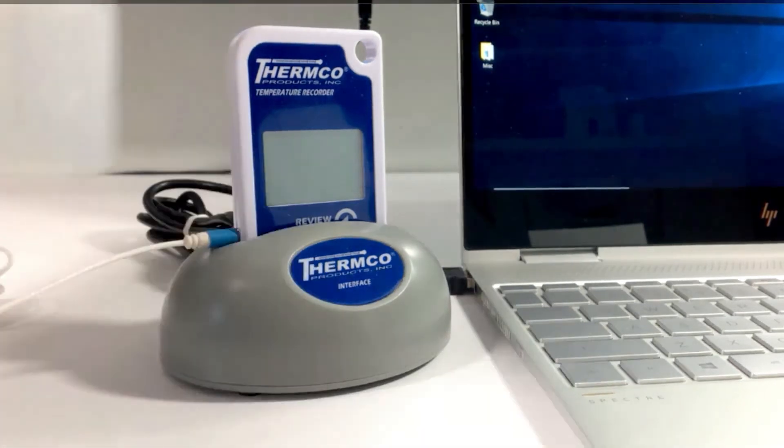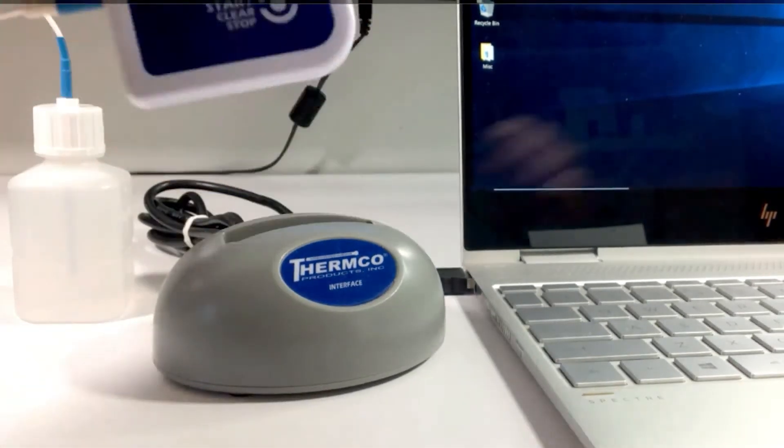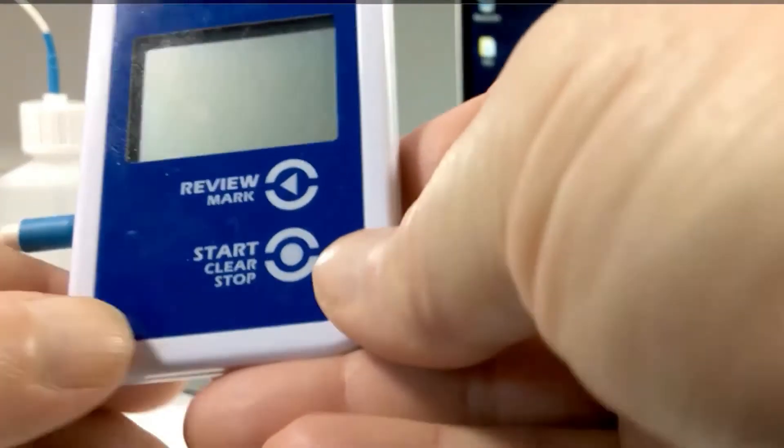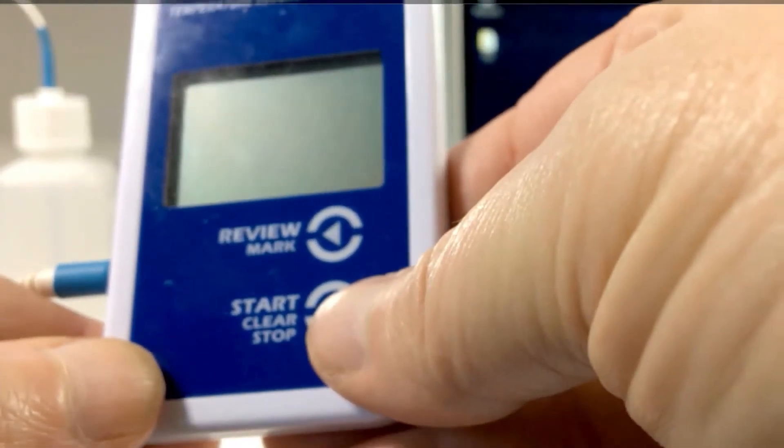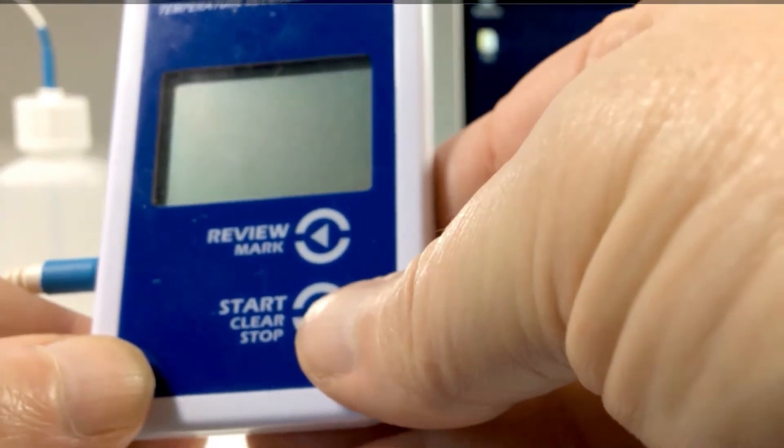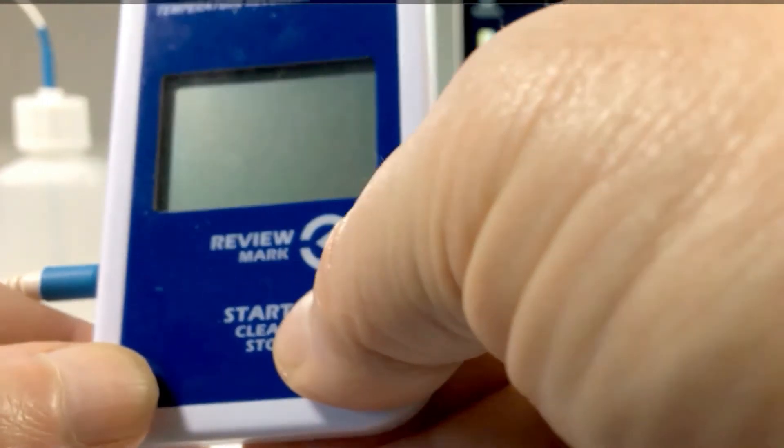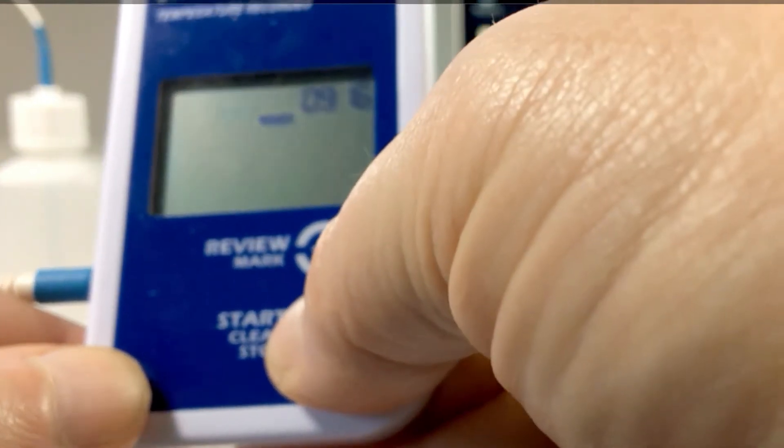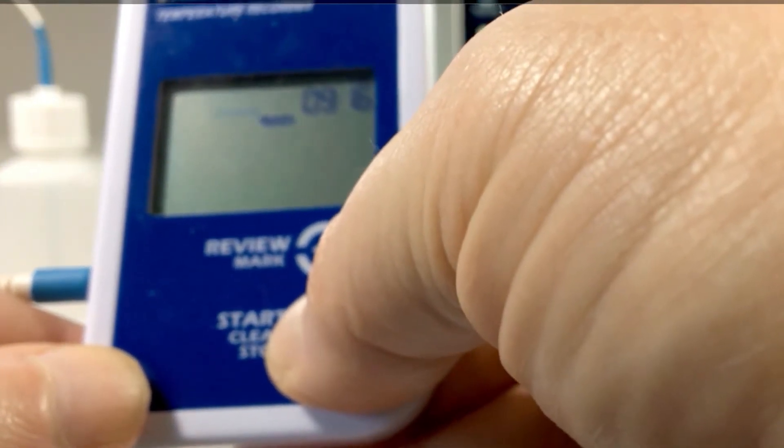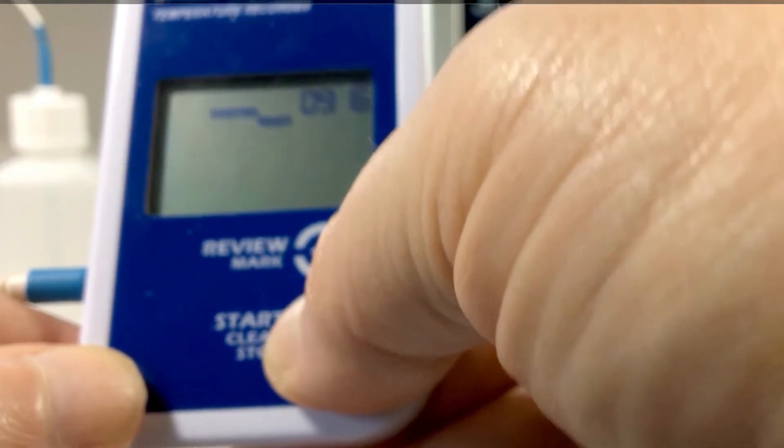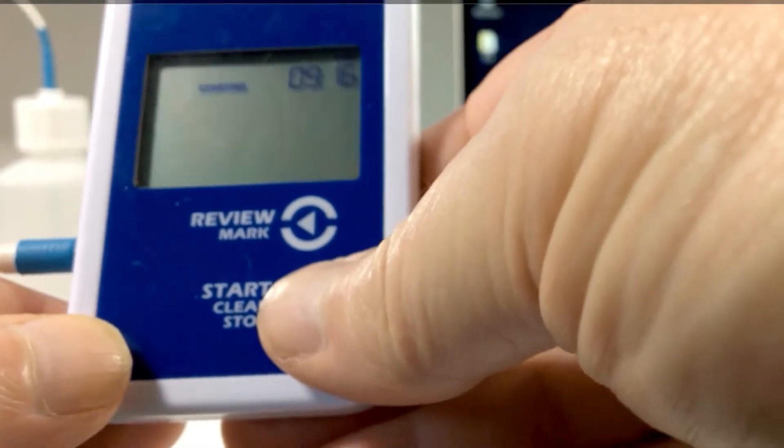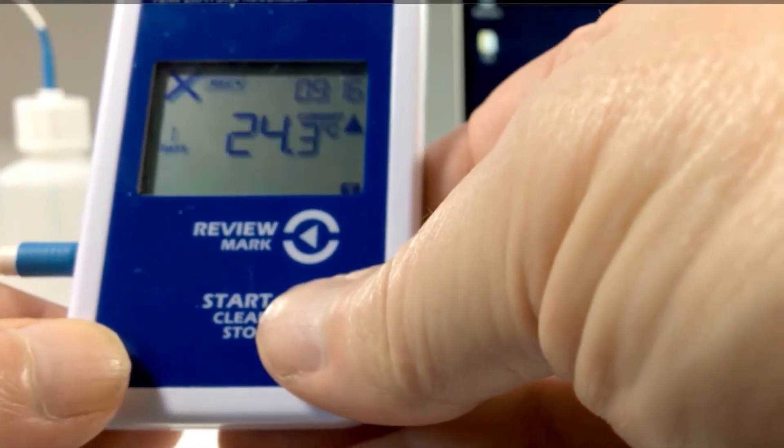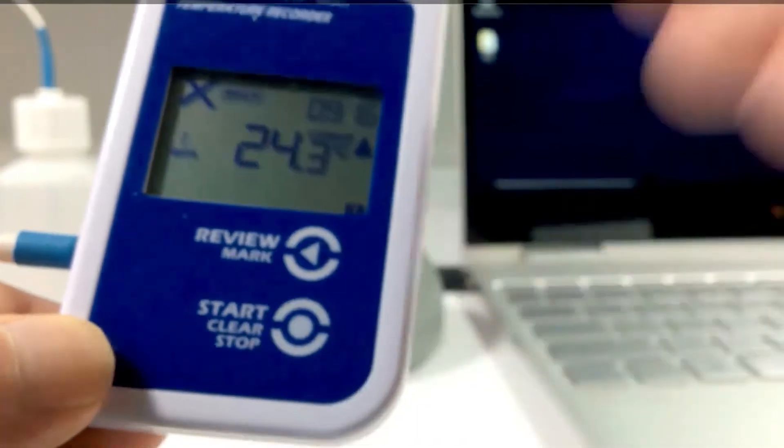To start logging, press and hold the start clear stop button. On the screen, the word starting will be flashing. Continue holding until the flashing stops, then release the button. You are now logging data.